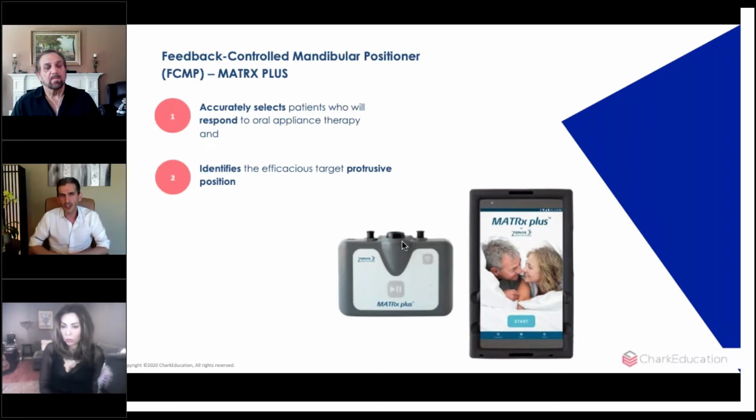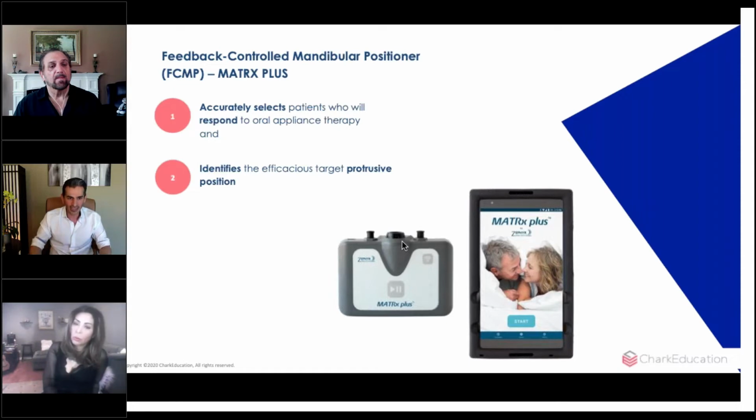I feel like this is going to be the next 10 years of dental sleep medicine, if you ask me. It's going to be how we involve dental sleep medicine as part of general dentistry, but focus on case selection and proper treatment planning, enabling every single dentist to be able to do the simple cases. And simple doesn't necessarily mean just a low AHI. Simple means something that fits within the whole picture. For instance, a young patient that doesn't have any restorative treatment and responds at a very low level of protrusion, that's a simple case. However, you can have a low AHI of 10, but a patient that requires 20 different restorations with an existing TMJ problem, and a lot of other comorbidities, that is not a simple case, and we need to consider how to include that into actual dental treatment.